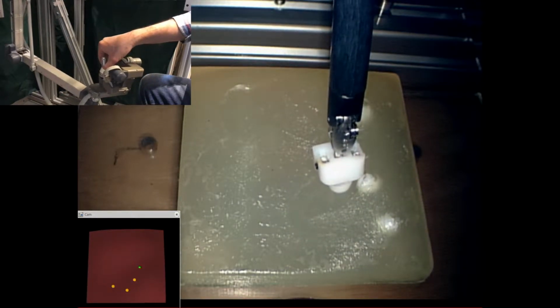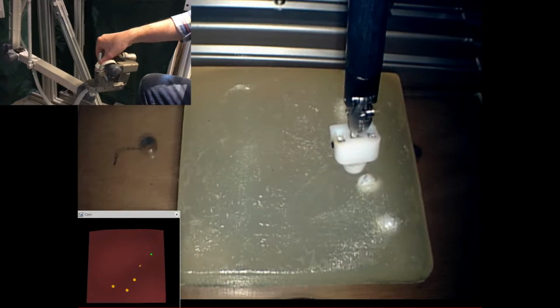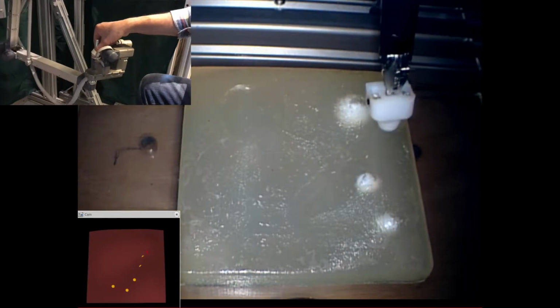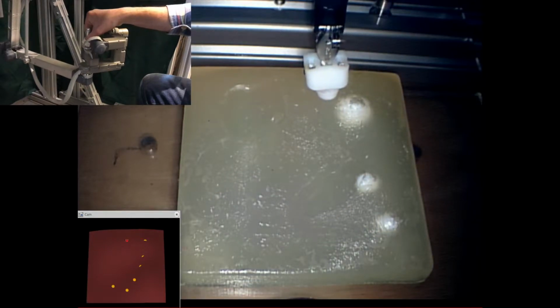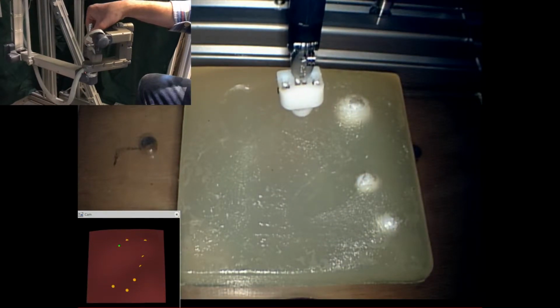Motion is unconstrained in the X and Y directions, but restricted in the Z direction via the interaction of a model of the slave robot and the registered a priori model of the silicone phantom organ. The model estimated forces are displayed by the red arrow in the bottom left.